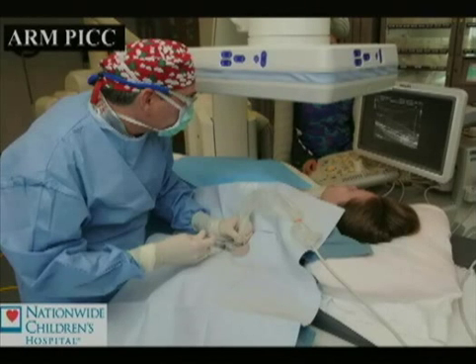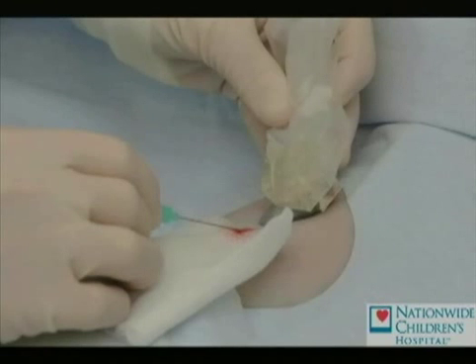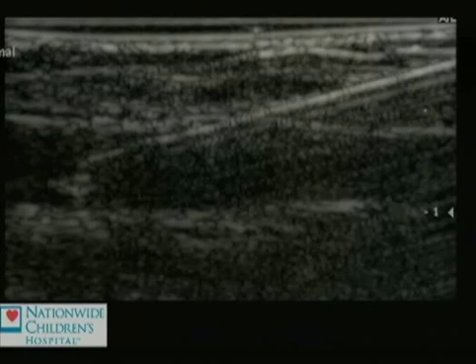When we're not approaching femoral venous access, the most common approach in the interventional radiology department is to use the arm approach for central venous access, or a PICC line, a peripherally inserted central venous catheter. Here we see in that long axis view the 21 gauge needle accessing following the transducer placed in the sound beam with this very lightweight hockey stick probe. And here we see the needle tip clearly in the basilic vein with good central location with a single wall puncture technique.